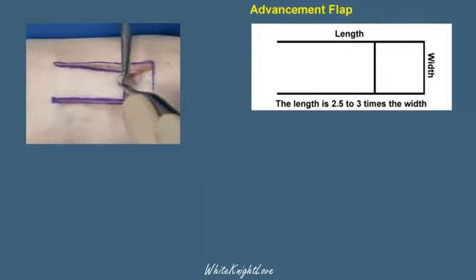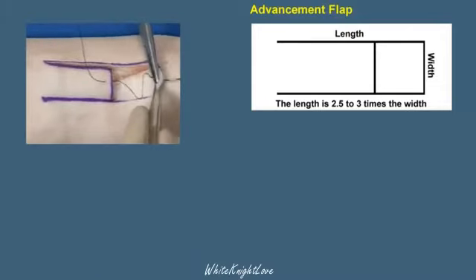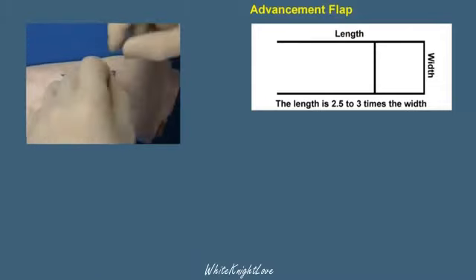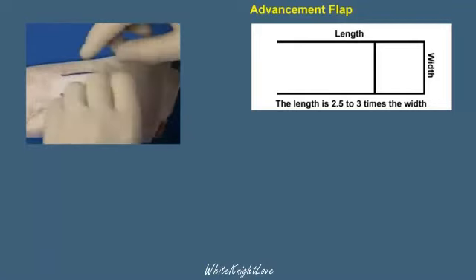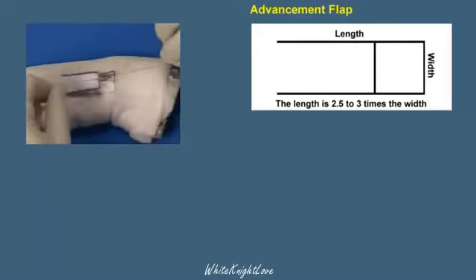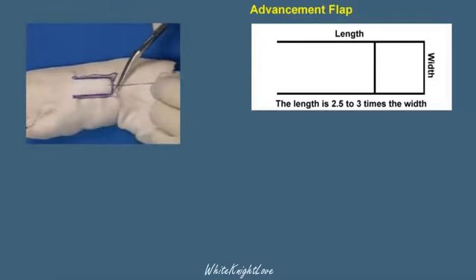The first suture is placed in the center of the flap and out the central aspect of the defect. This is tied with a hand tie and a surgeon's knot to prevent slipping. By keeping constant tension on the sutures, one can prevent tying an air knot. The suture is cut with a small tail.